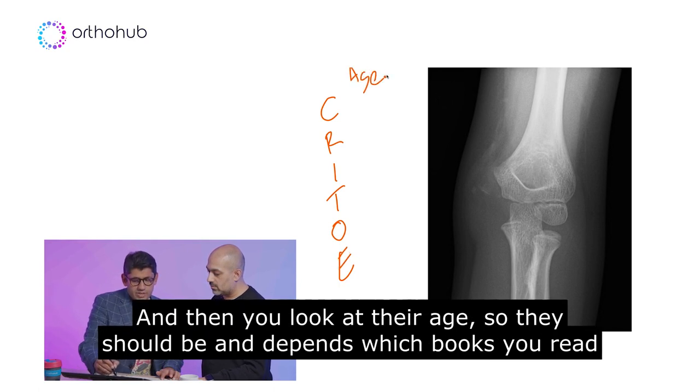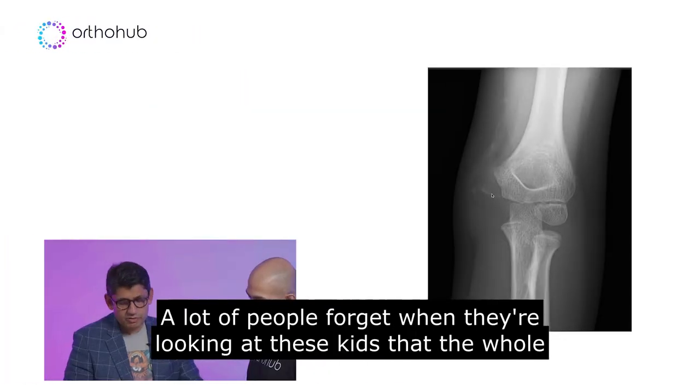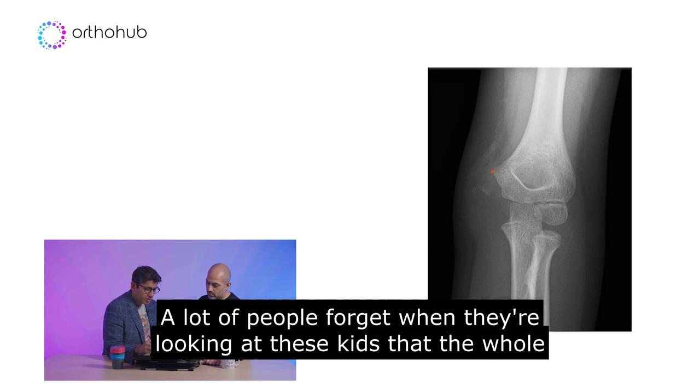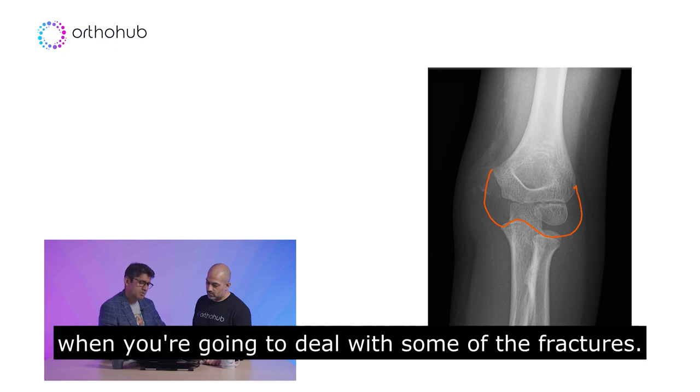And then you look at their age. Depending on which books you read, the ossification centers should appear at 1, 3, 5, 7, 9, and 11. A lot of people forget, when they're looking at these kids, that the whole thing here is cartilage. And that's really important when you're going to deal with some of the fractures.